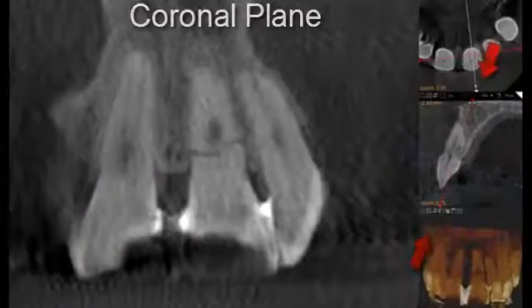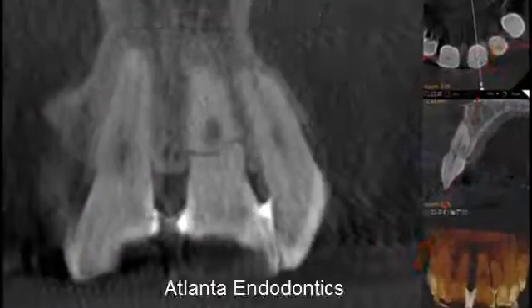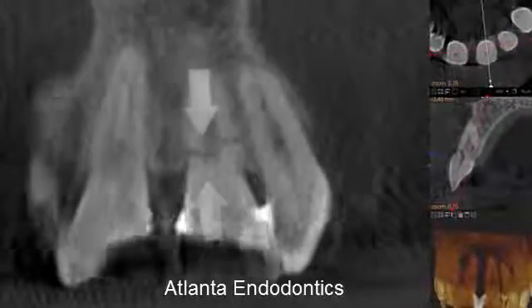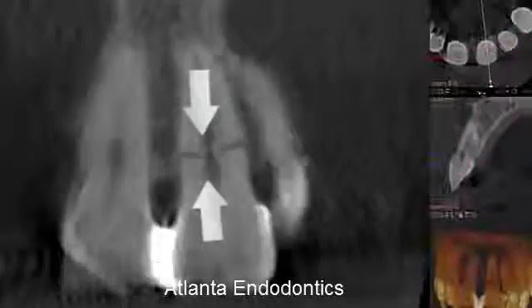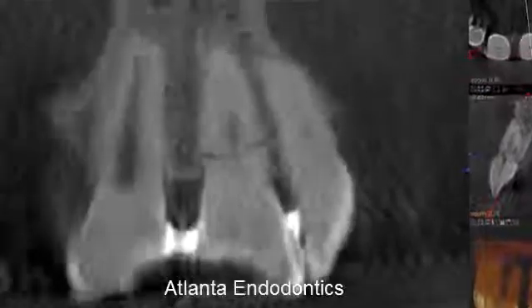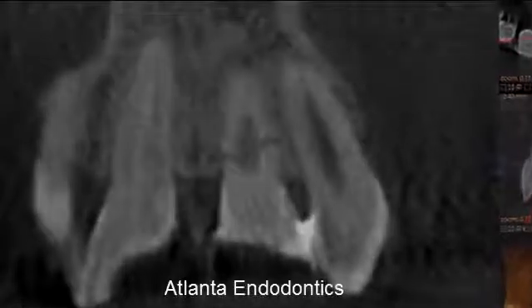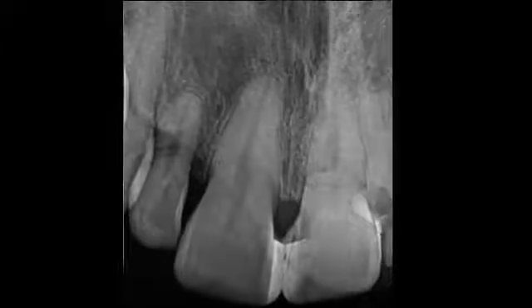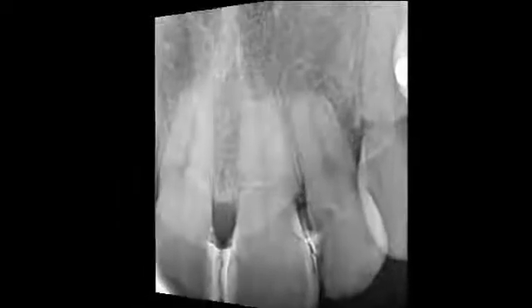In this scan of this upper left front tooth, moving in the coronal plane from the back of the head to the nose, we can clearly see the outline of the horizontal fracture. When we compare the scan to the traditional two-dimensional x-rays, it's apparent that something is going on, but we can't determine the extent or the nature of the fracture.